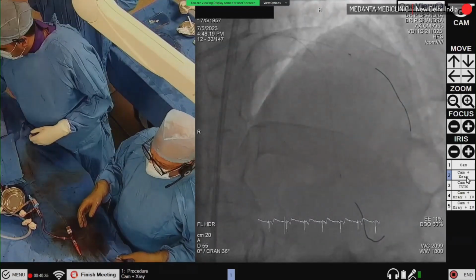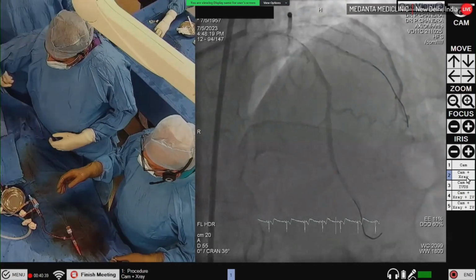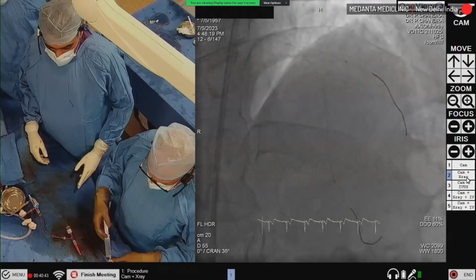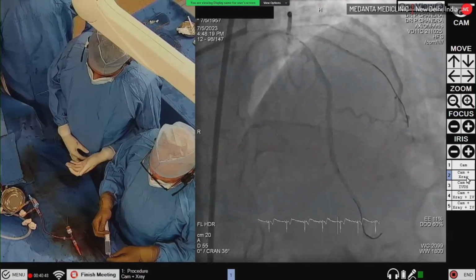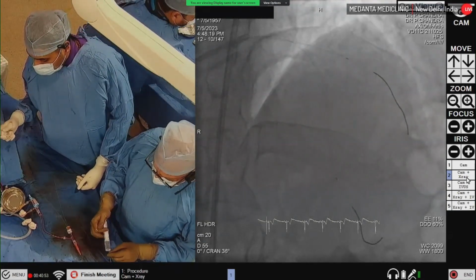There is one more question. Are there any calcification or plaque characteristics that may impact the choice of cutting balloon? The question is if there are different plaques where we choose different kinds of cutting balloons.